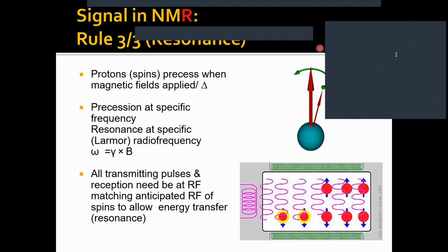Okay, so one magnetic pulse will align the protons by giving energy. And the key reason is that after you send the pulse, these protons will relax and release that energy, and that's how we view the MRI image.